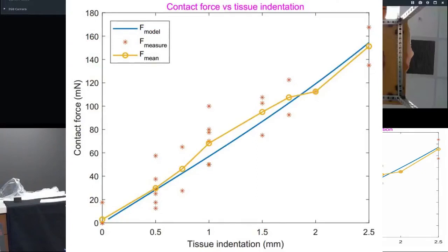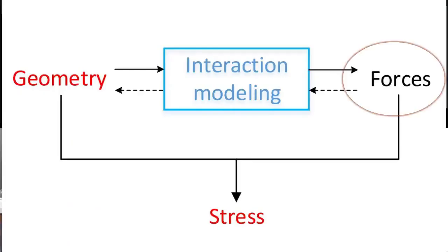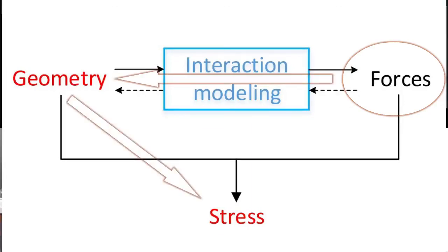The simulated data using the model showed great agreement with the experimental data, which indicates effectiveness of the model. Once the contact force is measured, this model can be used to predict indentation as well as stress distribution.